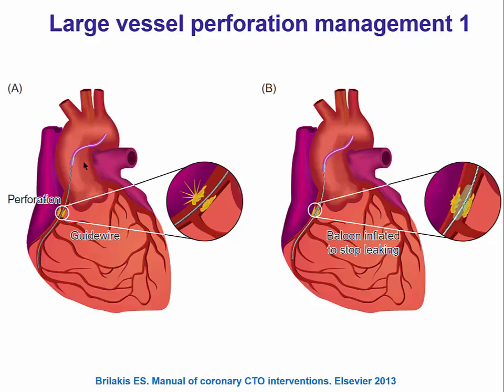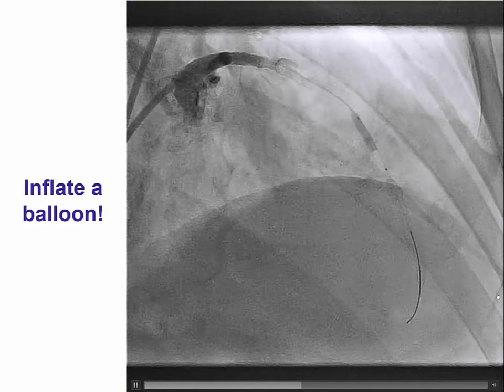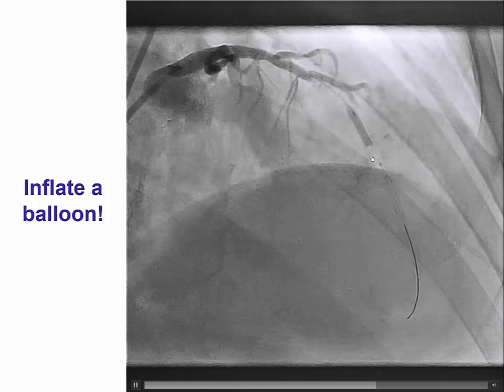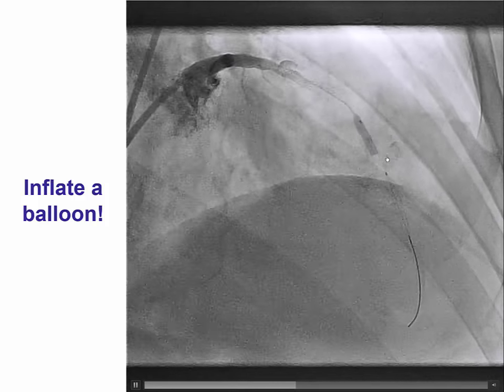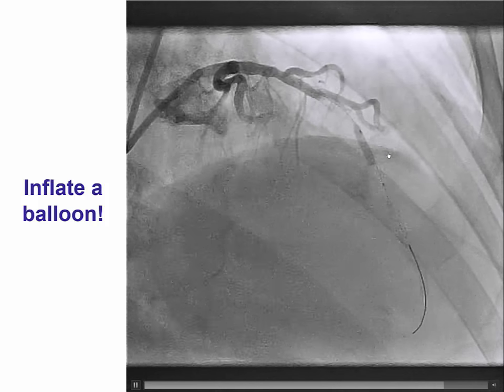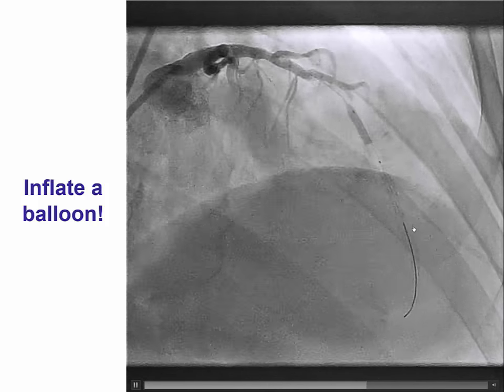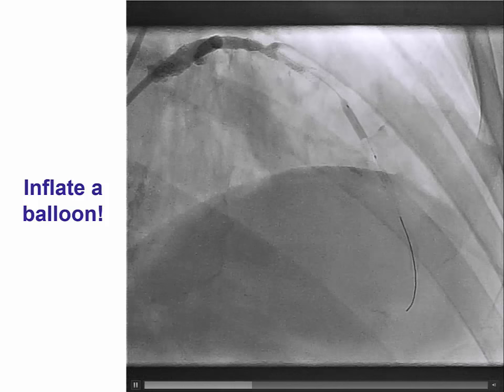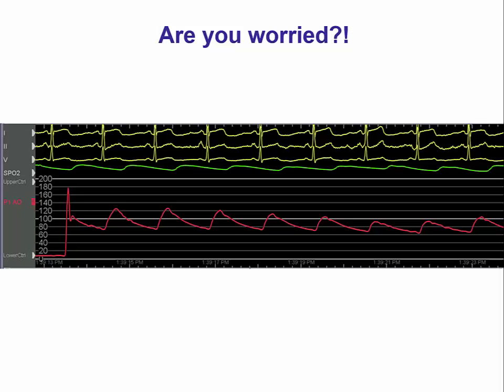Diagrammatically, the perforation is here. The very first step is to get a balloon at the site of perforation, or proximal to it, and inflate it to stop the leakage. That's exactly what we did in this case—you can now see the balloon is inflated and there is no more bleeding into the pericardium. However, the patient is going to become ischemic, which is why we want to continue with other treatment strategies.